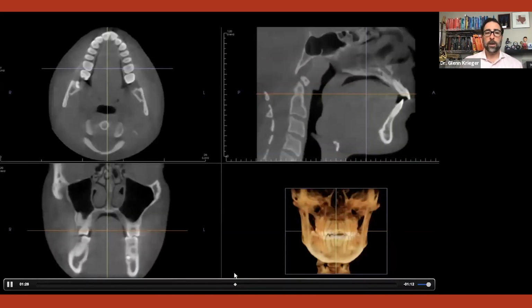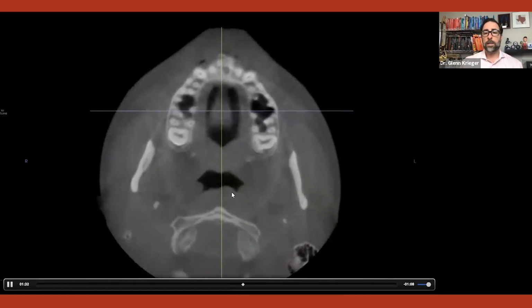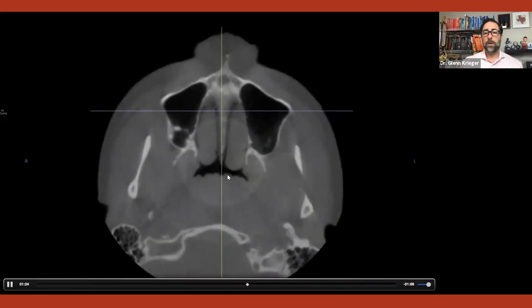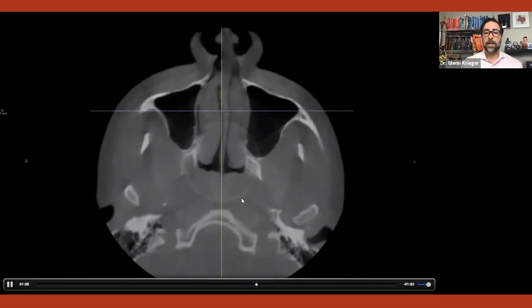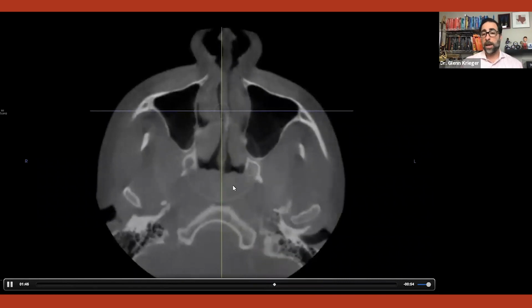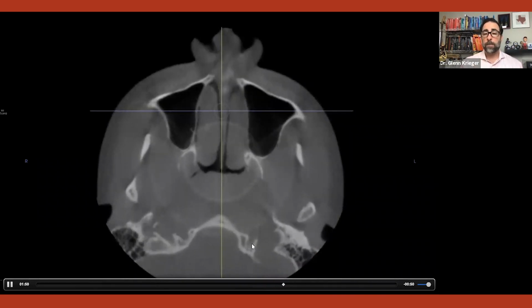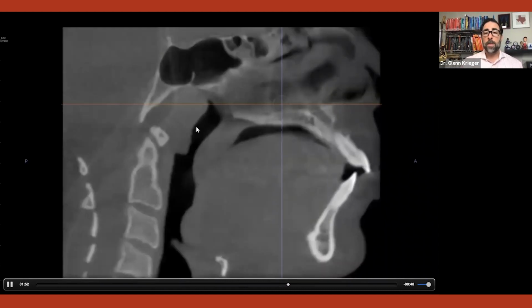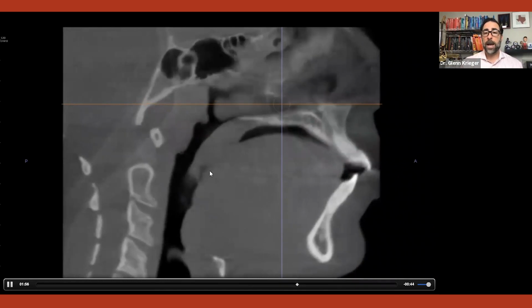I want you to look here and I want you to see this, right? That area, as we look from a different angle, you'll see it come back, is the adenoids, right? So look how big his turbinates are, right? Everything was big, but back here, when we went into the throat, the pharynx, you'll see there are your adenoids, right? Look at the soft palate area.